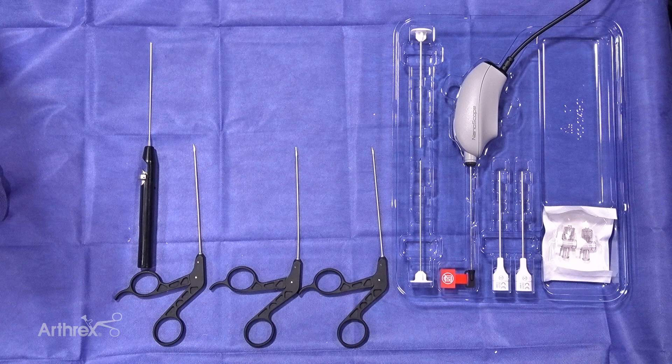You have a blunt trocar and a sharp trocar to allow you to insert, two inflow cannulas, and two stop cocks. What makes this set special is you can do dry arthroscopy, limited fluid arthroscopy, and if needed in the OR you can use a pump or gravity.